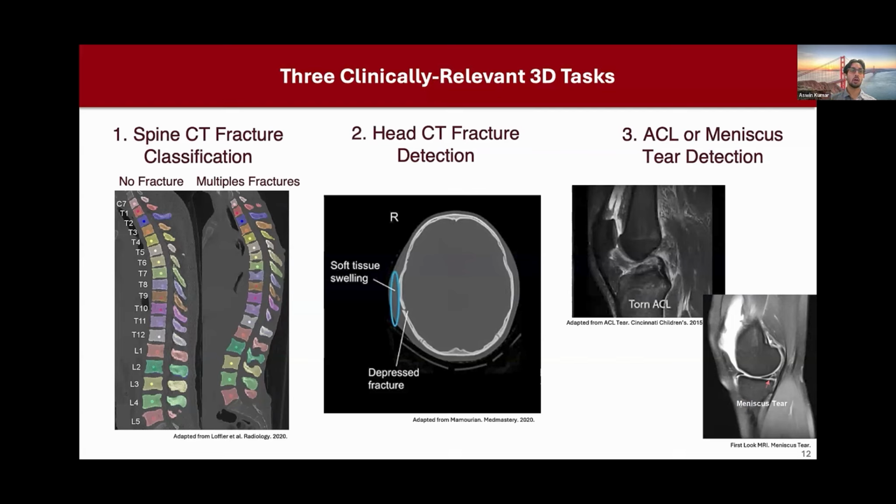And so that's some intuition as to why interpolation may not work as well as these 3D models, perhaps. It's just that a fracture that spans multiple slices is effectively compressed, and that signal is reduced as to what a fracture really is, whereas the 3D approaches really highlight that component. Additionally, there are really varying types of fractures. So it's not just your typical break, especially in the spine CT fracture task. There are often wedge fractures or different kinds of compression fractures too. So it's not always fully clear, but it's nice that our models are able to learn these different types of fractures, even using these latent representations.